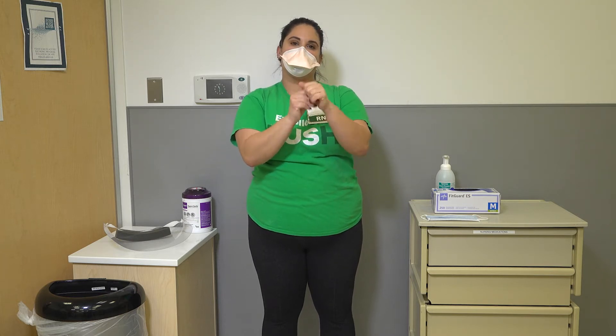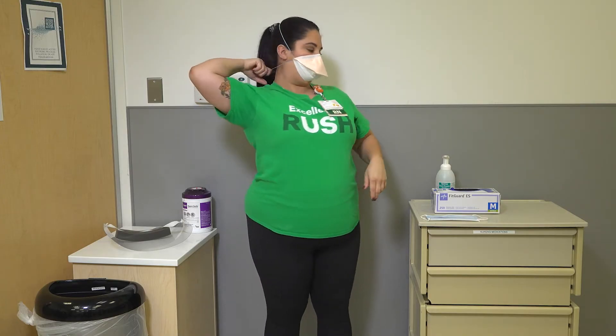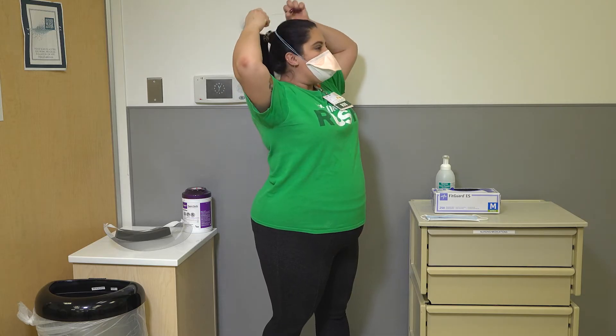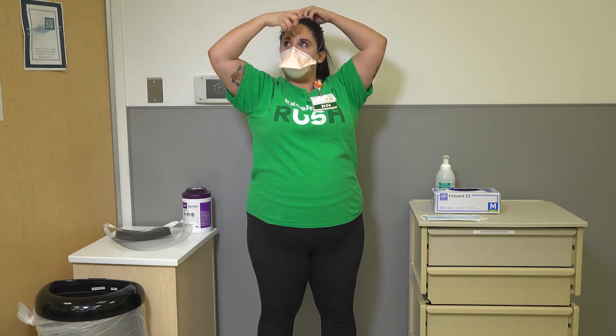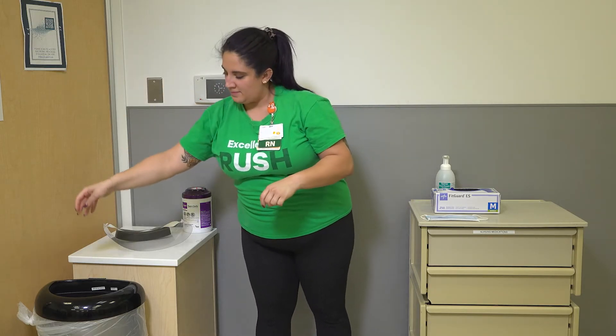Perform hand hygiene, then remove your N95 respirator. When removing your N95 respirator, grasp the elastic ties at the bottom of the neck and top of the head. Pull the ties up and over the head without touching the face. Discard in a waste container and perform hand hygiene.